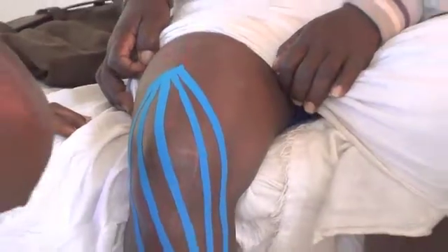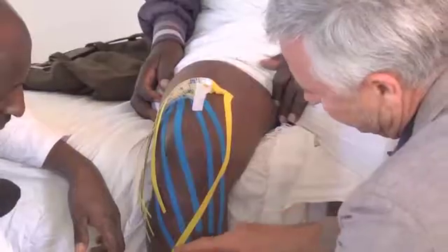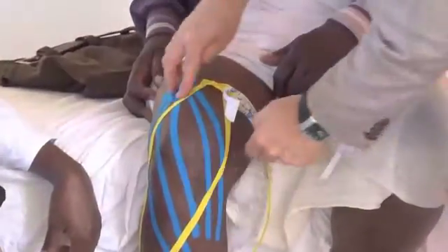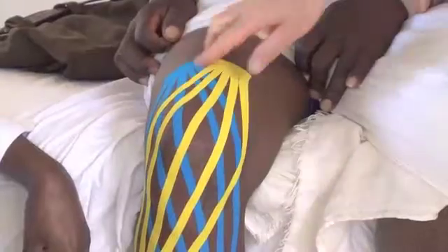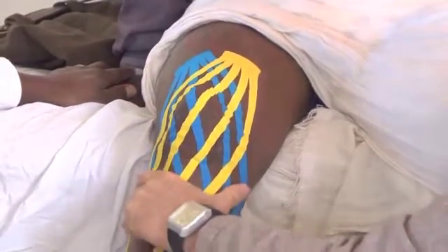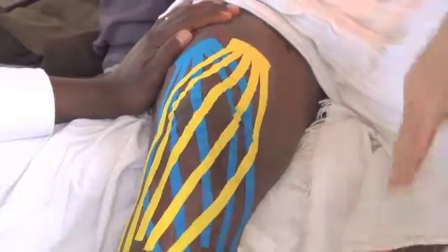So you see how the tape finishes like this, in this direction. Two centimeters, no more than two centimeters. Over the tibia. You get the last one: lateral condyle, lateral ankle, external ankle. Then you get number four on the lateral border of the patella, going down. So when the patient extends, you see it's going to wrinkle like that. Up and then down.